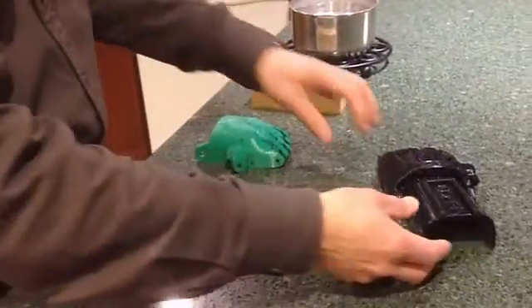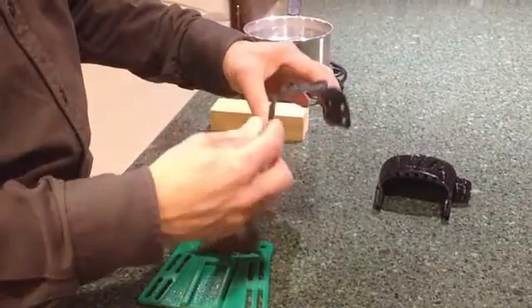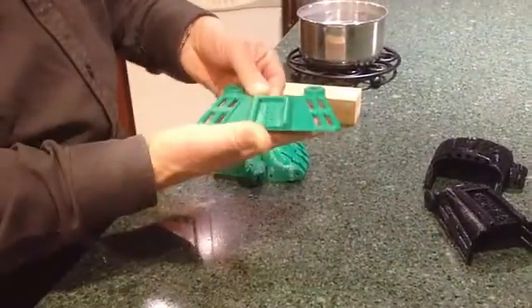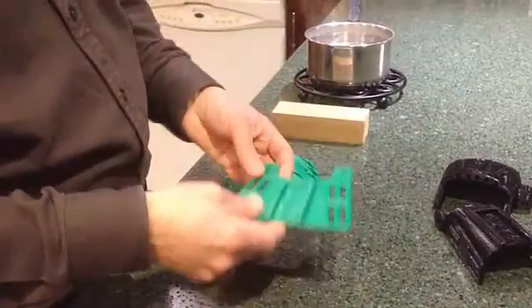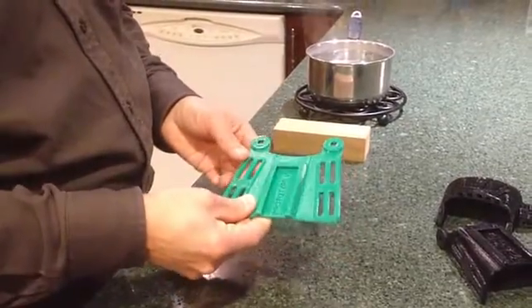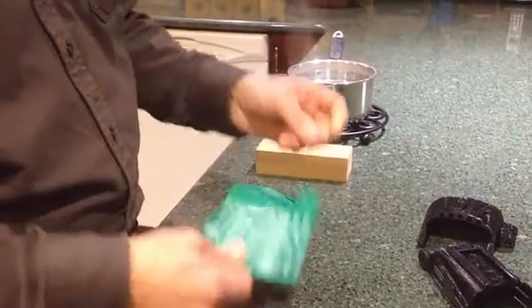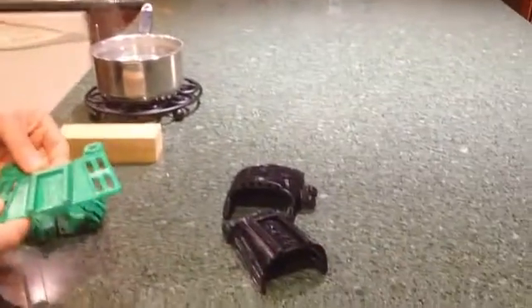The general idea of thermoforming is to produce a three-dimensional gauntlet, but instead of printing it in that shape, it's actually printed flat on the bed. It doesn't get its three-dimensional shape until it's bent using heat. This gives a significantly stronger design than the original fully three-dimensionally printed version.